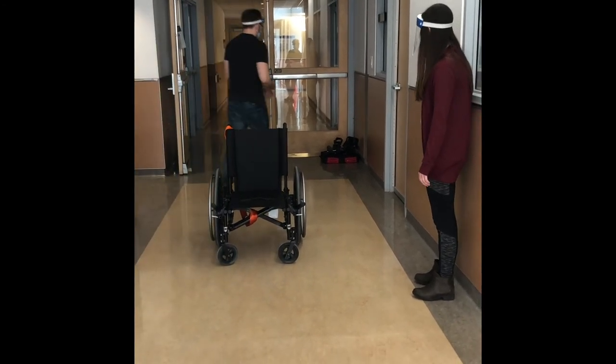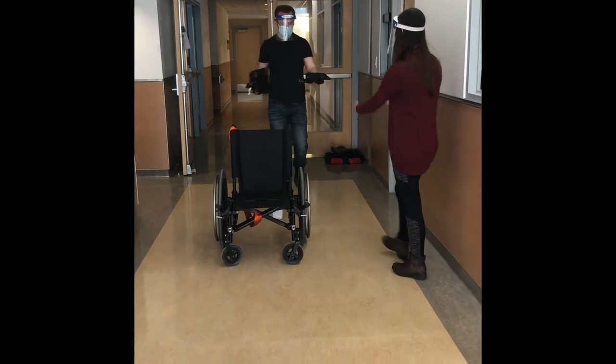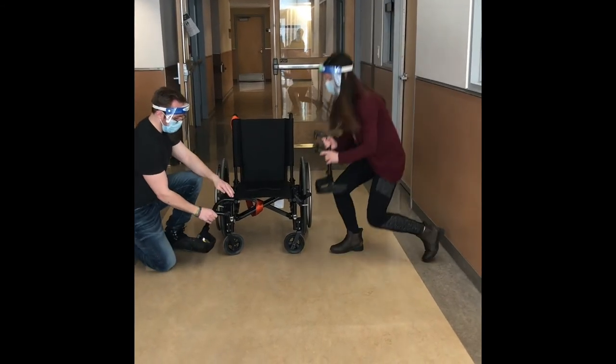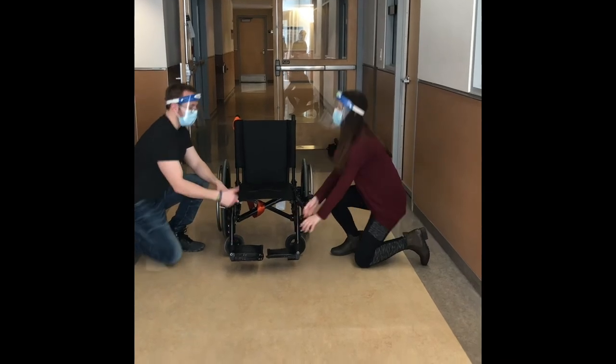Next we'll grab the other pieces. We'll put the foot pedals back on — we're going to do the opposite of what we did to take them off. Set it in the hole like that, click it around. When you hear a click and it's tight, you've got it perfect. Good job.